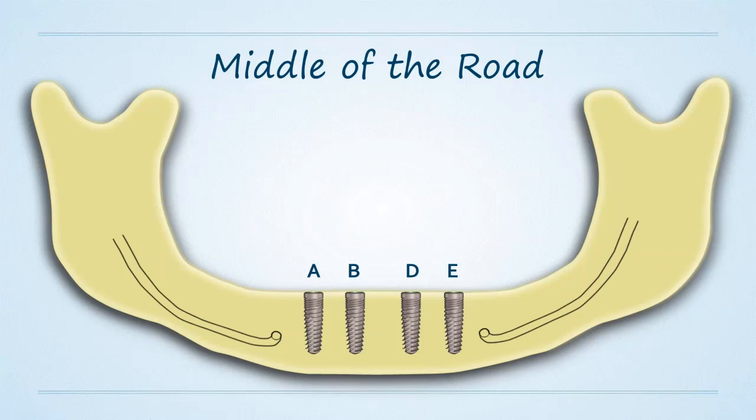I can tell you from my scientific publications, yes, a 2 implant overdenture is equally as effective in patient satisfaction as a 4 implant overdenture. But what I can tell you also from my clinical experience in my practice is that it just costs a little bit more money for me to put in 2 more of these implants, 2 versus 4. Adding just 2 more to make 4 is just a few $100s more.